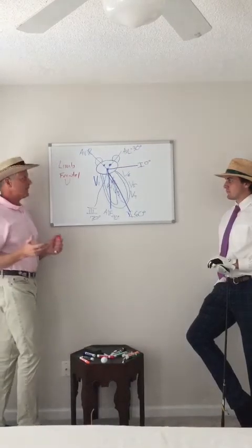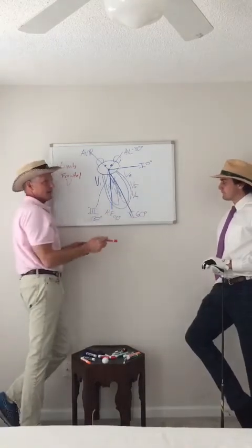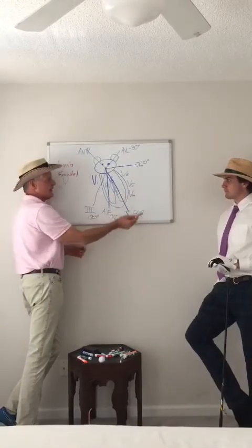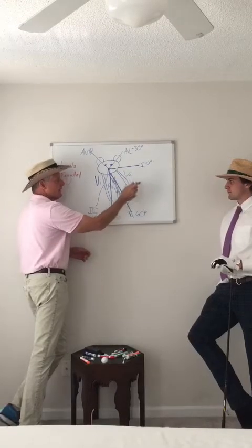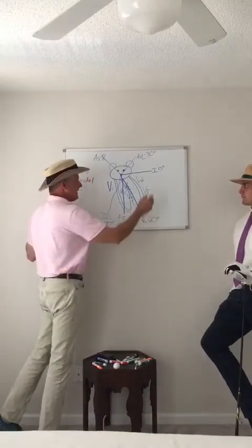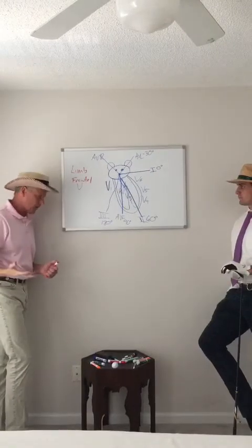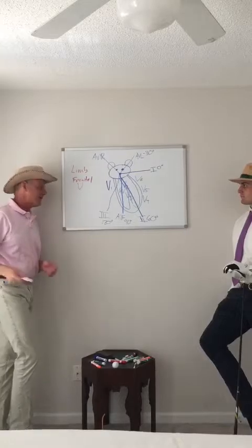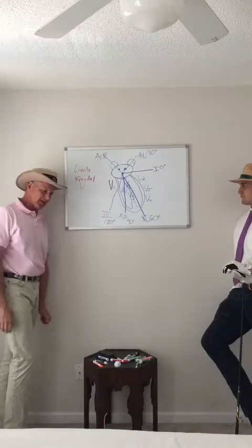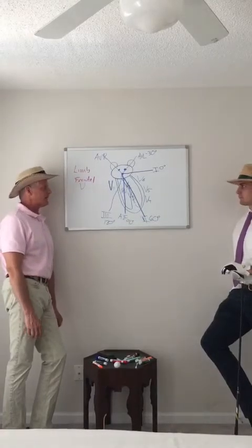So if we tell you ST segment elevation in a particular group of leads indicates an acute myocardial infarction, or heart attack, and you see ST elevation on the 12 lead EKG in leads V4, 5, and 6, then you automatically know it's an acute anterolateral myocardial infarction. If you see ST elevation in leads AVL and 1, then you know it's a high lateral or lateral wall myocardial infarction. And if you see ST elevations in leads 2, 3, and AVF, you're probably looking at a bonehead inferior wall myocardial infarction. We're going to apply that to everything as it pertains to the leads.